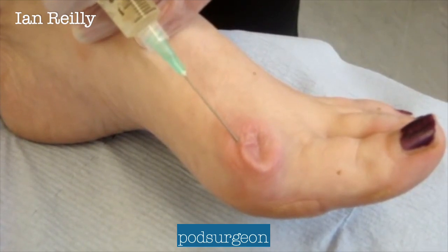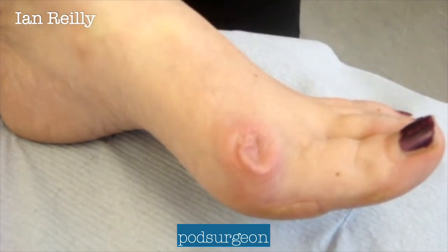Needle coming out in three, two, one — and out.